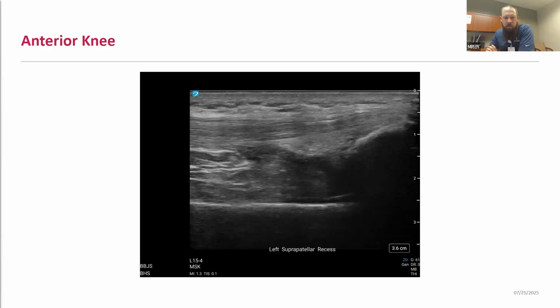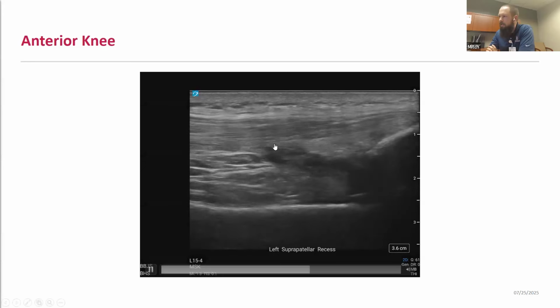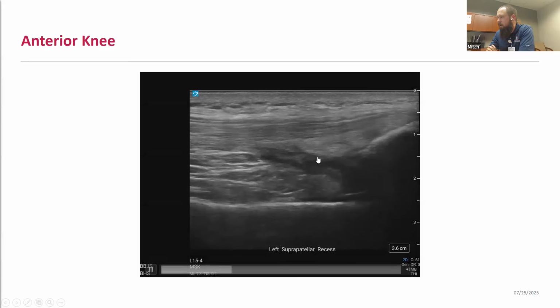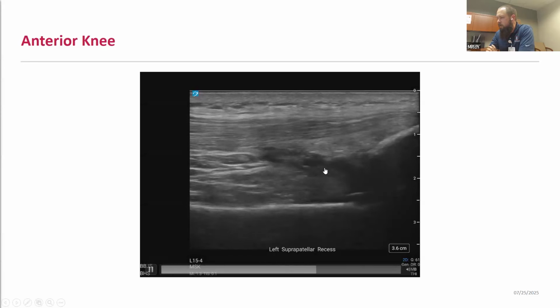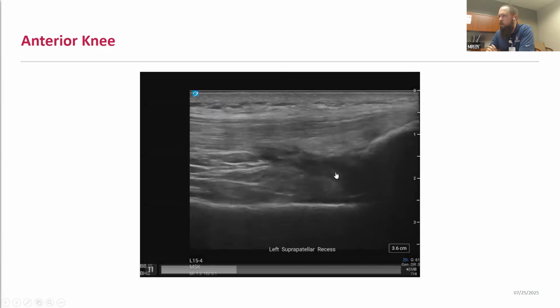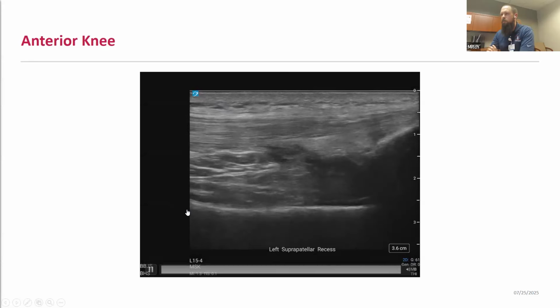If you're trying to identify the joint space, sometimes some quadricep contraction or increased knee flexion can pull some of that fluid up further into that recess. And so here the patient's doing a slight quadricep contraction, which can better delineate that joint space there. And that's especially helpful if you're doing any interventions such as aspiration or injection, especially injection in somebody that doesn't have much of an effusion at all.